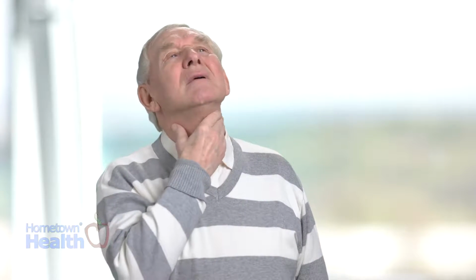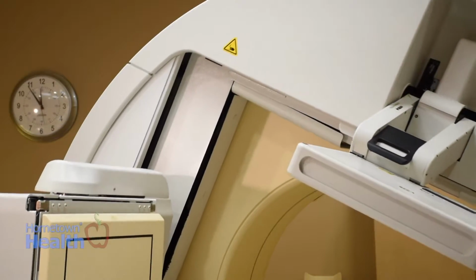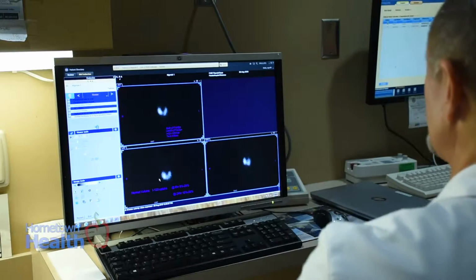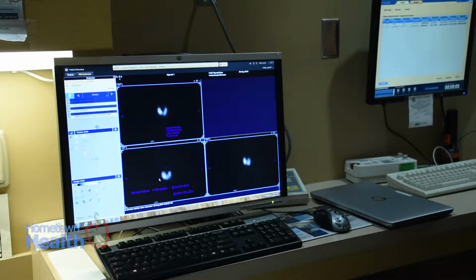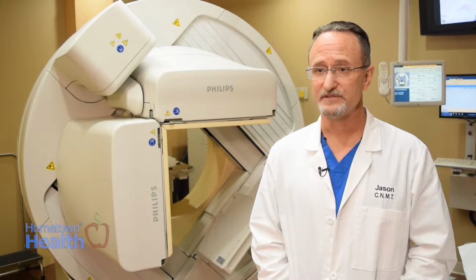You might feel a lump in your throat around your thyroid gland. If you have difficulty swallowing, things of that nature, the doctor would normally order an ultrasound of the thyroid just to see what they can see. That's not uncommon. The ultrasound of the thyroid is generally designed to look at any physical abnormalities. If there are any cysts or thyroid nodules, they want to see the size, the number, location, things of that nature. Once they find thyroid cysts, they'll generally do a needle biopsy.